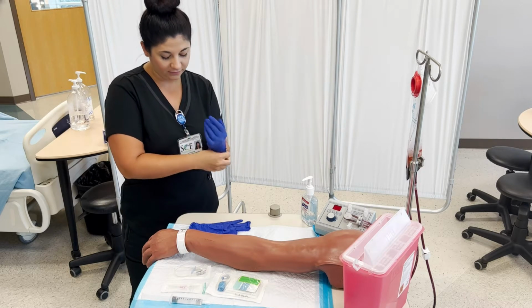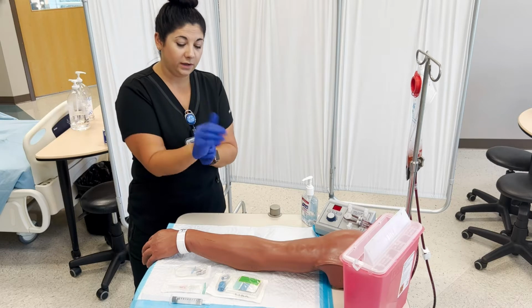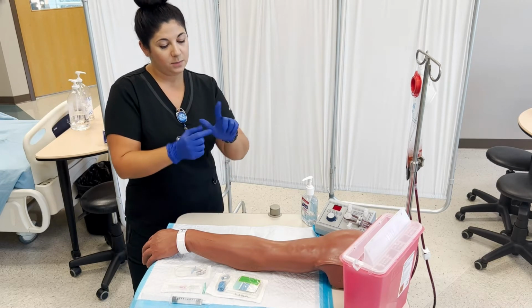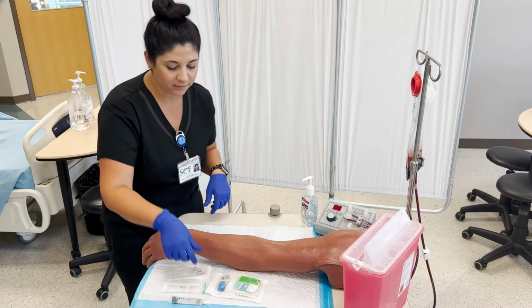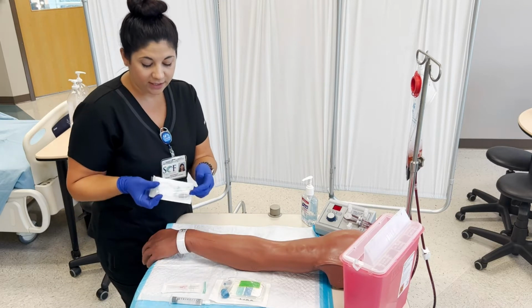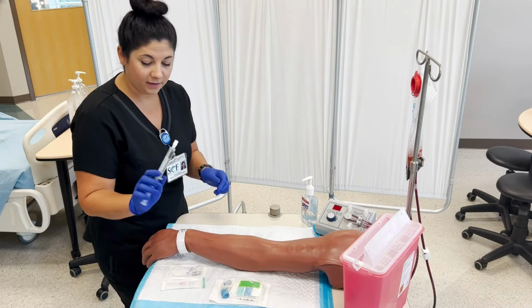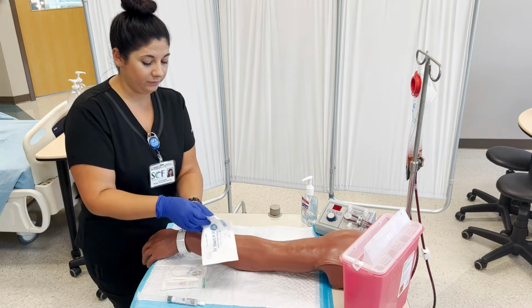Put some clean gloves on. I usually wear a medium-sized glove, but for IV insertion, I like to wear small because I want it pretty tight on my finger so I'm easily able to feel for those veins. I have all of my supplies here. So we have an IV start kit, a J-loop, an IV needle, and a flush. I'm going to open my start kit.